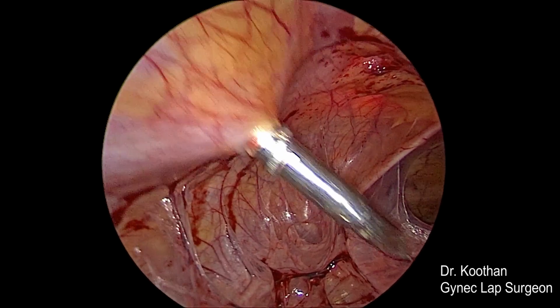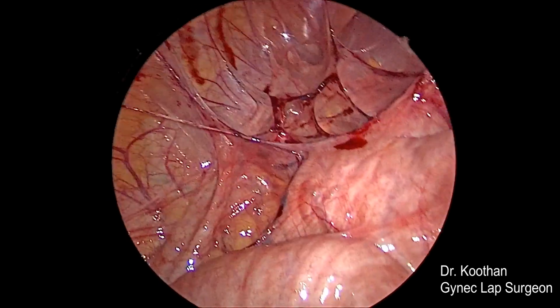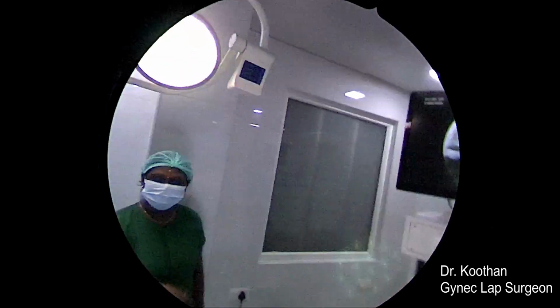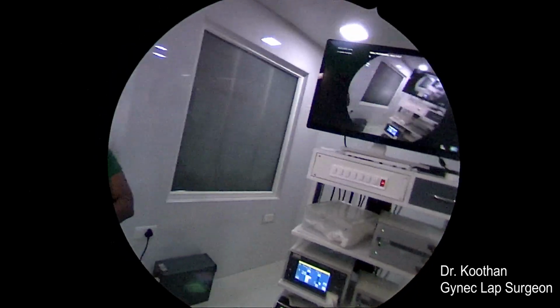So this is the secondary trocar, which is coming from the lateral abdominal wall. Now we are changing the scope to the newly put trocar to visualize the primary trocar.